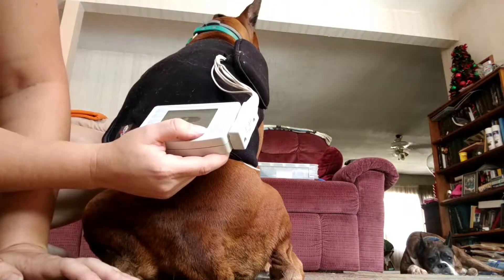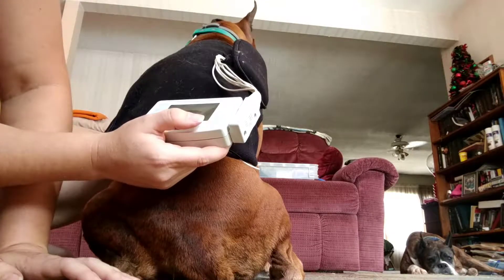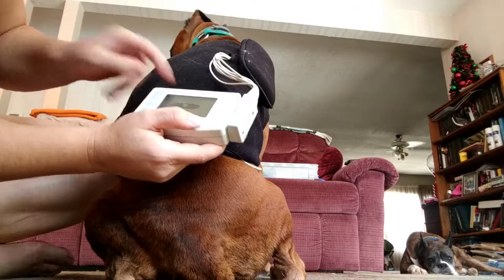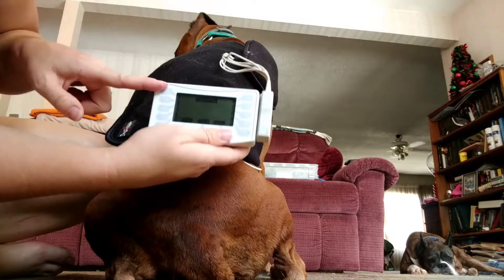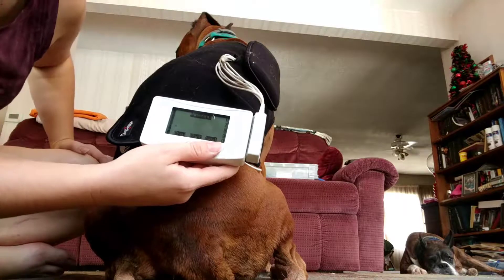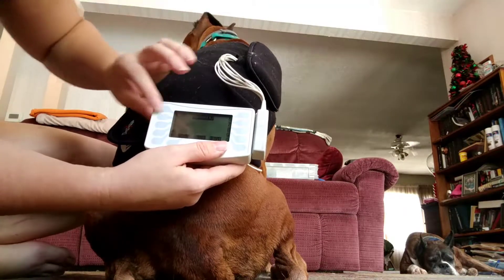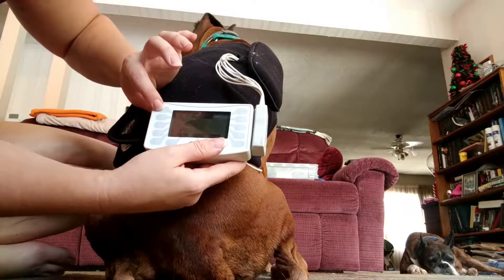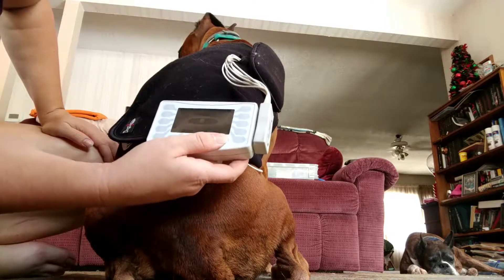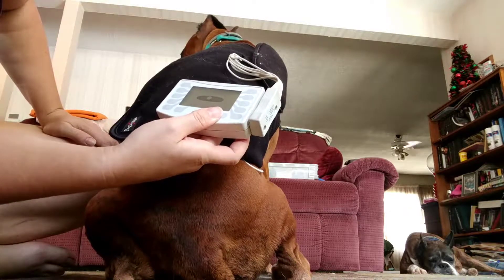On Northeast Monitoring, hit Next and New Patient. Hit New Patient at the top, and now you can select what number. If you're doing three dogs you can label them dog one, dog two, dog three, dog four — each time it'll let you put whatever number. We're just going to put dog one in the slot here, then hit Next, recording mode: three channel.